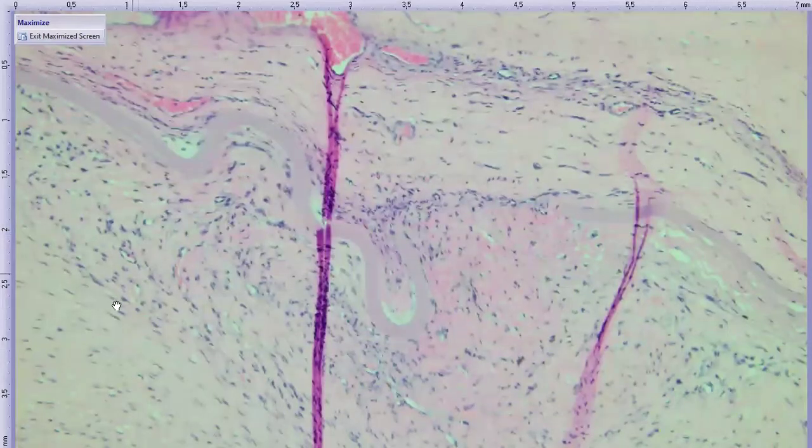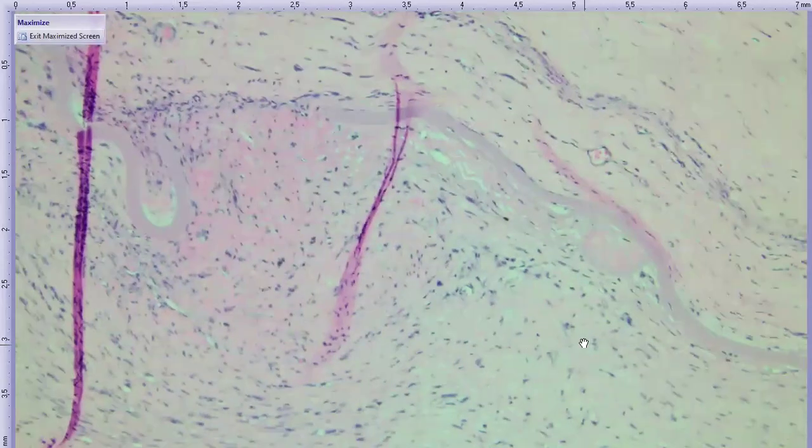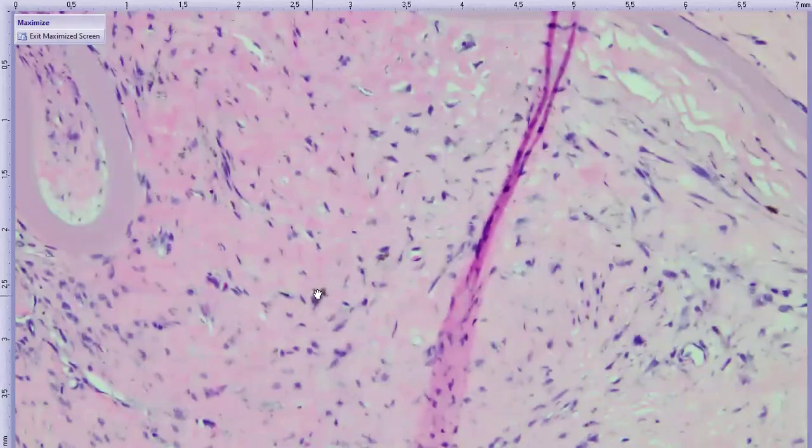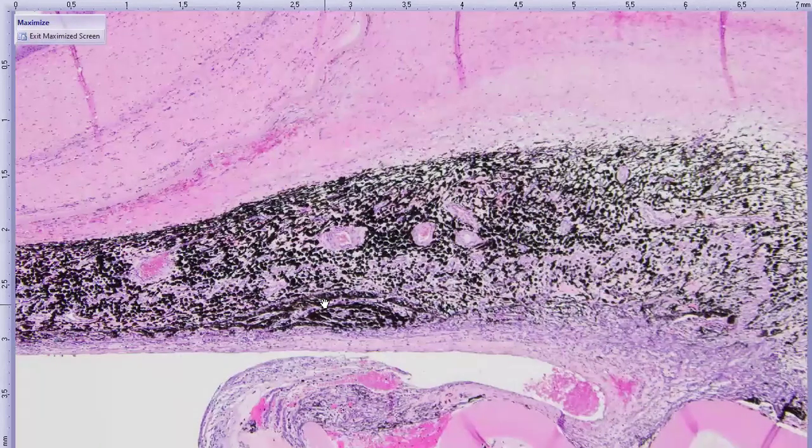And then in the anterior chamber, you can see it is basically filled with and occluded by this collagenous material with blood vessels in it. And there's a few inflammatory cells around here and there, and probably some melanin-laden macrophages and or hemosiderin-laden macrophages. So here's a cell with some brown stuff in it. As we move back, here is iris tissue. It is more heavily pigmented than we would normally expect for a normal brown dog iris, and it is very mildly expanded. So I think I did suggest that this eye has uveal melanosis.